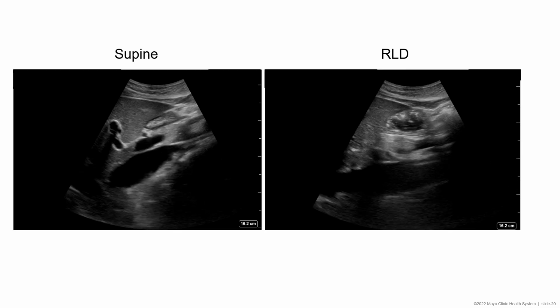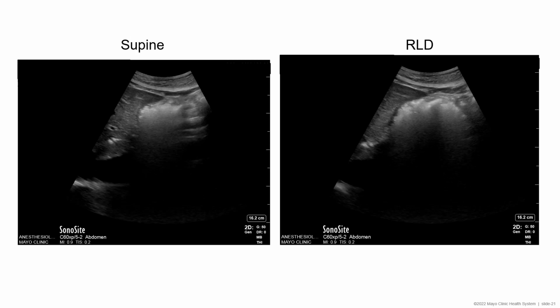So what do we see here? On the left, we have the supine image. We can see the dark ring of the gastric wall around the antrum. Again, we would include the dark gastric wall when assessing the area. When we turn to right lateral decubitus, we see that there are hyperechoic white speculations floating anteriorly. This is the fat of the yogurt that I ate, floating on top of water. Regardless of what the calculated area is, this is a full stomach because of our qualitative assessment of the hyperechoic solid fat.